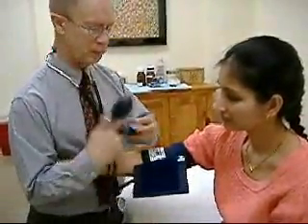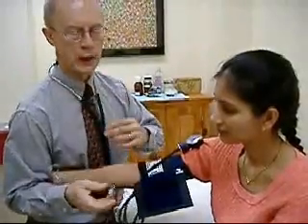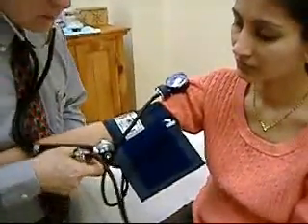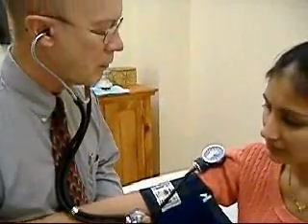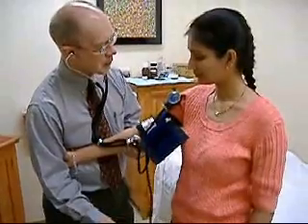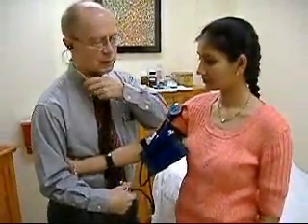Once again, we put the cuff on. This time I'm going to secure it to her sweater, because we'll have her moving and I think it's more secure that way. [Reading:] 90 over 60. Standing up now — 84 over 62. That was a tiny little drop, but not enough to concern us. Probably as much operator error as anything.